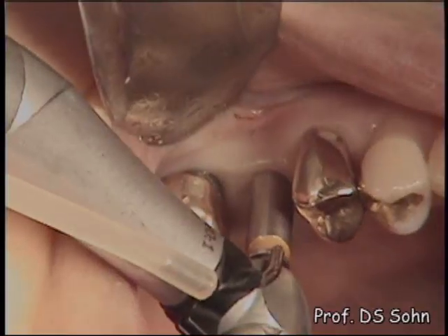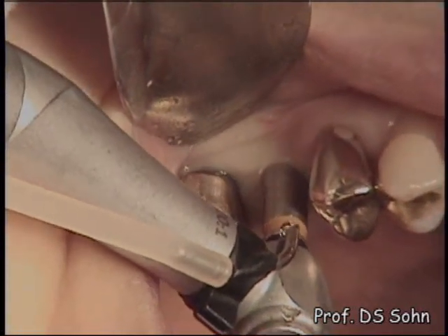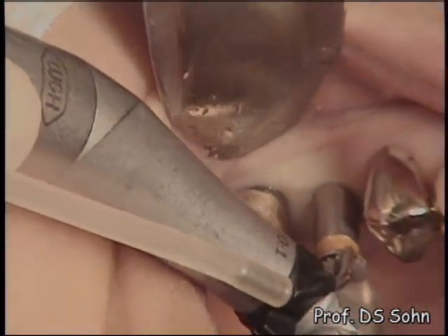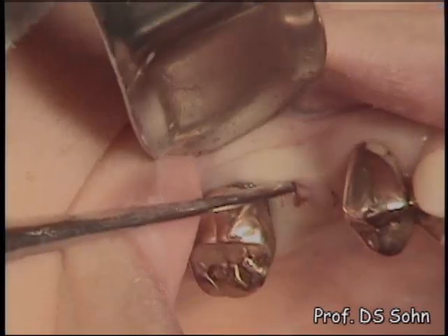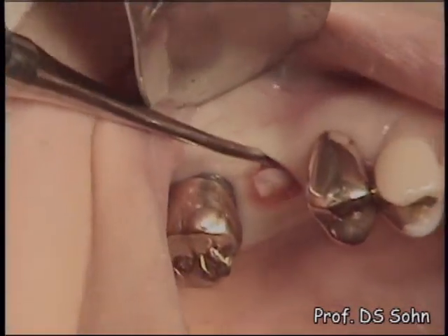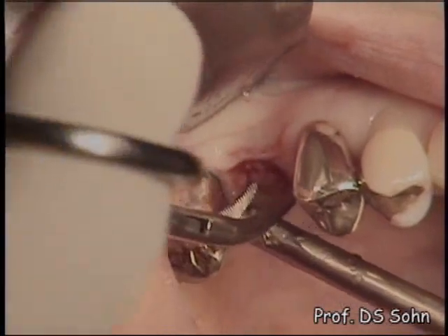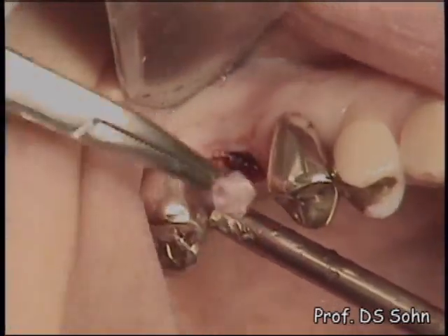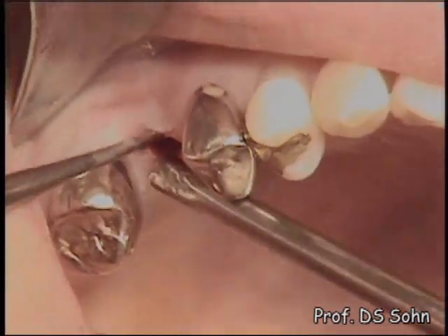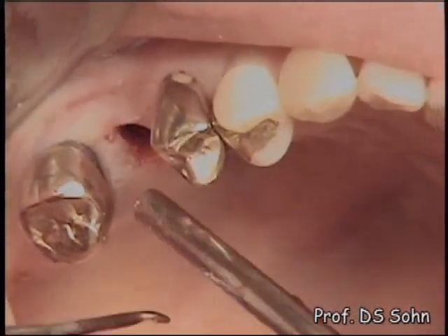A 4mm wide soft tissue punch attached with a handpiece of implant motor was utilized with copious saline irrigation to remove soft tissue. A soft tissue core was removed from the alveolar bone using a curette and hemostat. Remaining soft tissue on the alveolar bone was completely removed using a small curette.